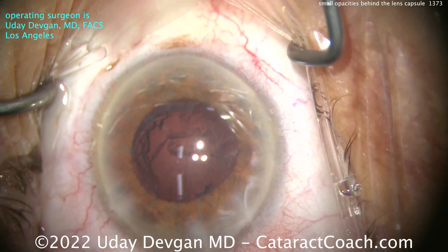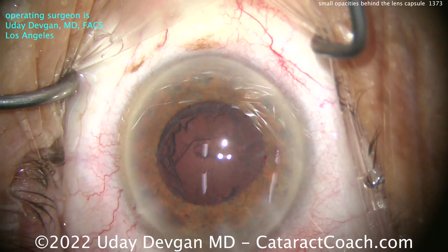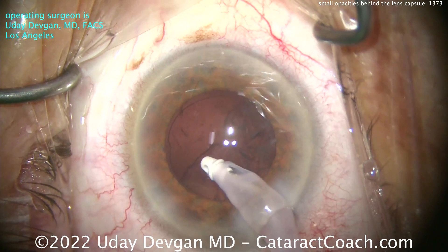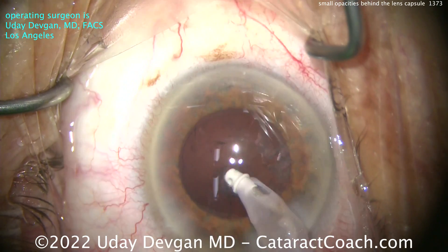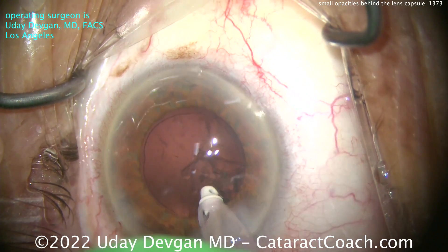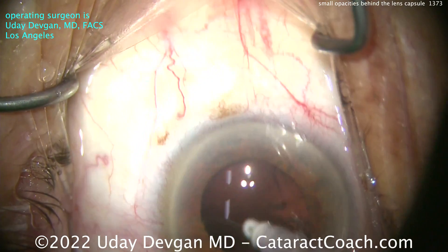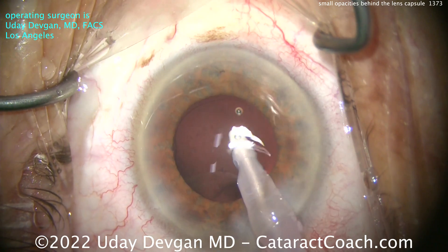Taking all these things down looks pretty good — there's just some cortex there now. After we remove the cortex, we're going to be able to see the pieces of lens material, tiny ones. I don't recommend going after them — they're going to dissolve on their own in the inflammatory cascade. So let's remove the cortex, and then we'll take a good look back there. In the anterior hyaloid face, we're going to have a little bit of lens material. It's not going to affect the outcome of the case; maybe there'll be a little more inflammation post-op. This is a case where I'd say let's put a little extra steroid — maybe put some triamcinolone in the anterior chamber at the end of the case.